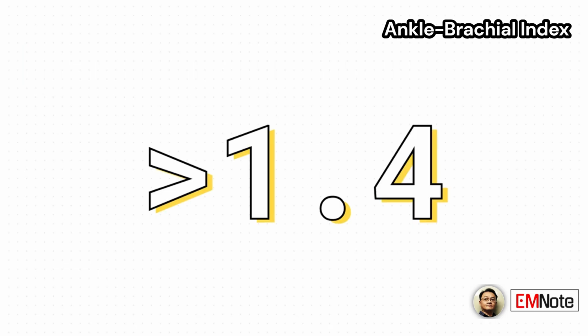Now, what if you get a value that's really high, over 1.4? That's also an abnormal finding. It suggests non-compressible or calcified vessels. You often see this in elderly patients or those with long-standing diabetes, and it also warrants a referral.